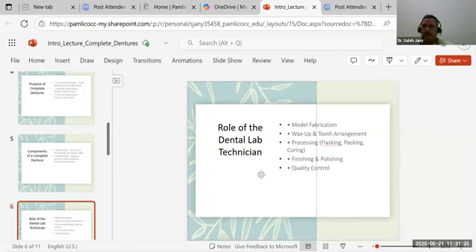Okay. The first step, the dentist takes the first impression and sends it back to you. On the first impression, you make a study cast. On the study cast, you make a custom tray or special tray and send it back to the dentist. The dentist takes the final impression, which is a good impression. You pour that impression and you make a master cast. This is the cast that you're going to keep, a very good cast because it has a good quality impression.